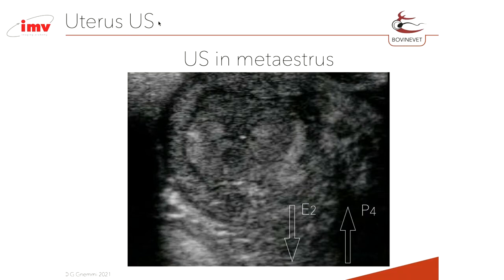Well, can we distinguish between the dominant follicles by ultrasound? No. Also working with the Doppler. But what we can analyze is the different hormonal profiles in the two different windows. At day 14, we are at the end of the diestrus, so progesterone is the main hormone, while at day 18, the main steroid hormones are the estrogens.